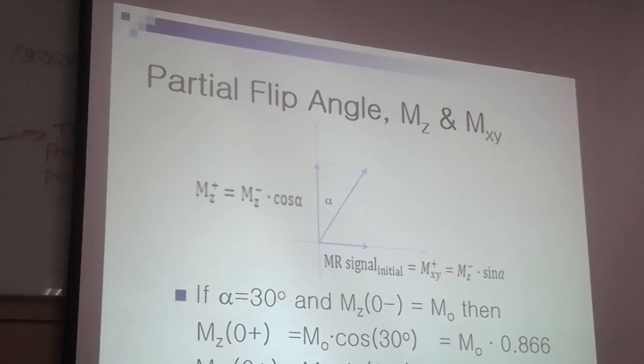And I would like to explain about the partial flip angle. What is the partial flip angle? Strictly, partial flip angle equals low flip angle.